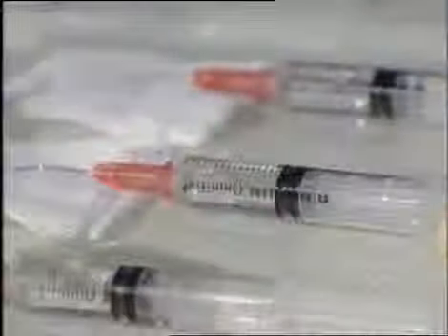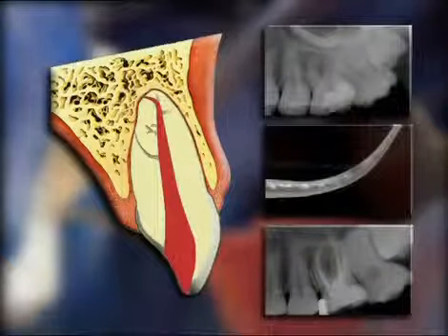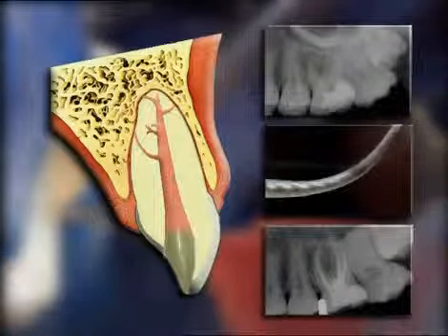It also acts as a lubricant and keeps the dentinal mud in a loose suspension. Sodium hypochlorite is used constantly and without any pressure. Shaping refers to a logical cavity form that any dentist can fill. Shaping facilitates cleaning. Well-shaped canals consistently demonstrate well-obturated canals.